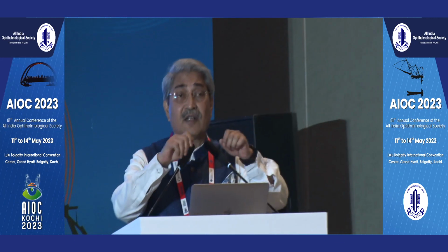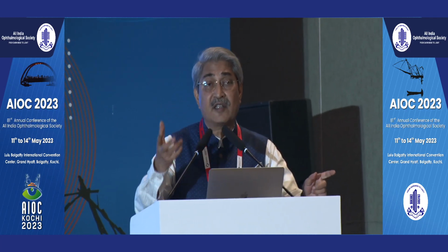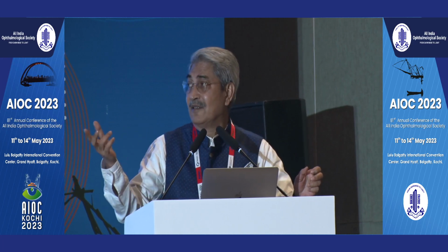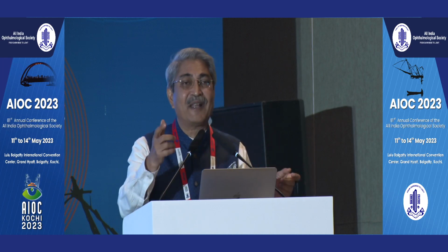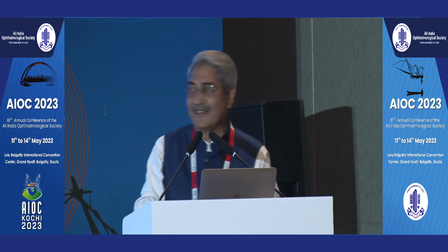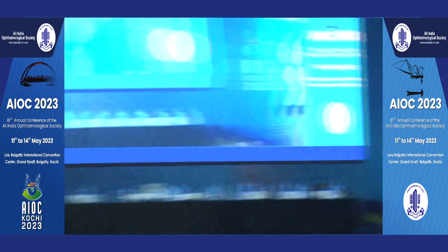That is not a glass injector, that is a cartridge. Sensal multi-piece cartridge. I have a video, I'll show you. You can look exactly at what he has prepared. You just break it like that. It is a plastic. AR40 actually. You can create that with any of your IOL cartridge, and it will go through a 2.8 millimeter incision.